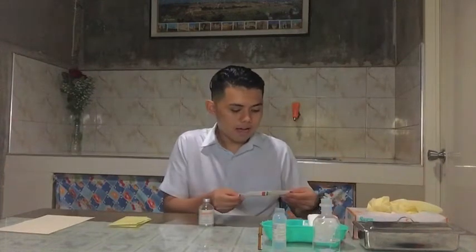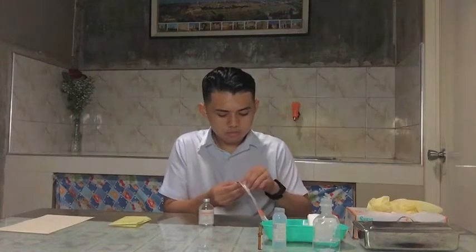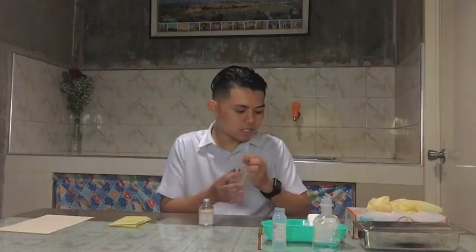Some vials contain aqueous suspensions which settle when they stand. Then, withdraw the medication. Attach a filter needle to draw up premixed liquid medications from multi-dose vials, and ensure that the needle is firmly attached to the syringe. This is for us to avoid injury and error. And of course, let's unpack the intradermal needle. Always make sure to dispose of all of the wastes.